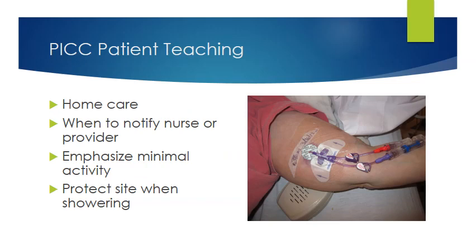Well, we have to teach them about care at home because these people go home with a PICC line and they have to take care of it at home. So they've got to know how to flush it, and if a dressing occurs, or if the corners of the dressing pull up, then they have to know that they need to let the doctor or the physician know so that they can come out and change that for them. So we need to teach them the home care.